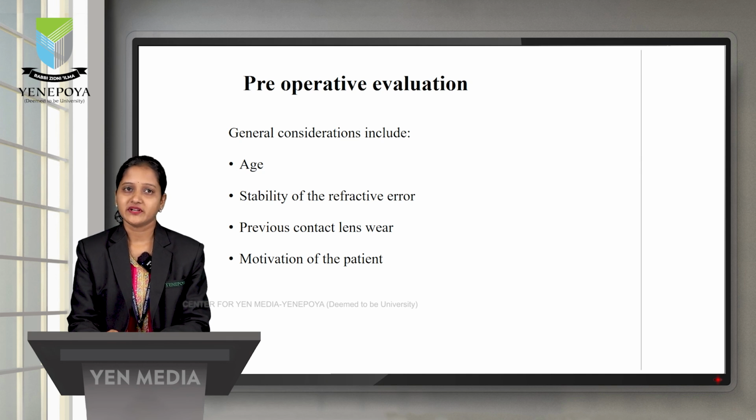To begin with the pre-operative evaluation, mainly as an optometrist, the general considerations that we look at are the age of the patient, stability of the refractive error for the past 6 months, previous contact lens wear history and how motivated the patient is.